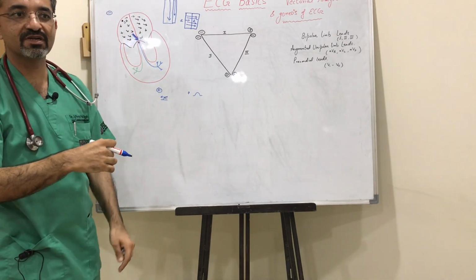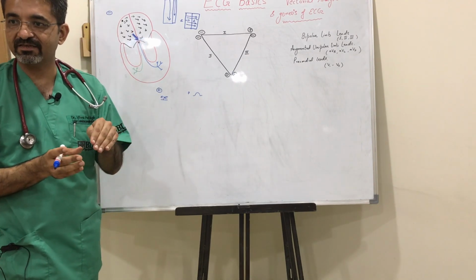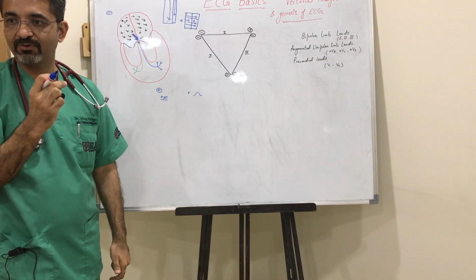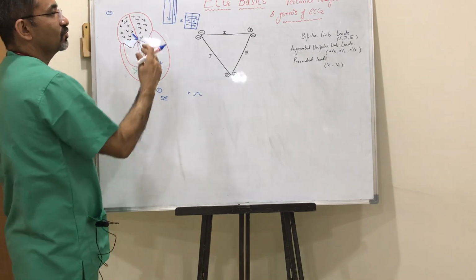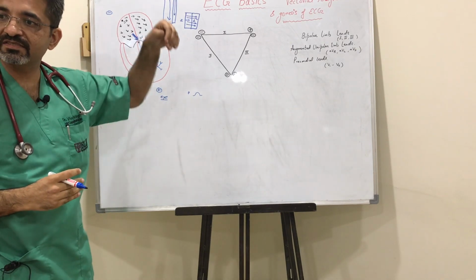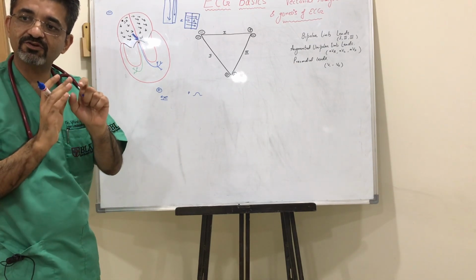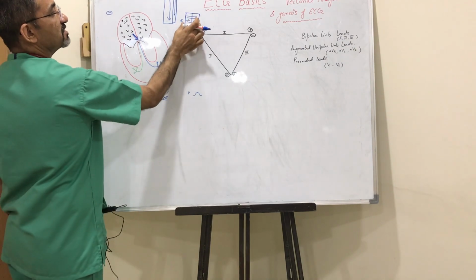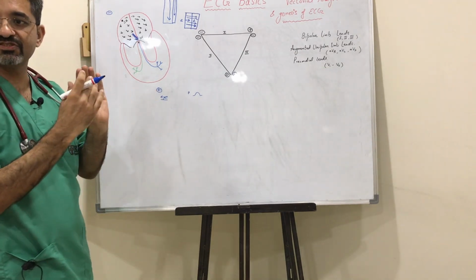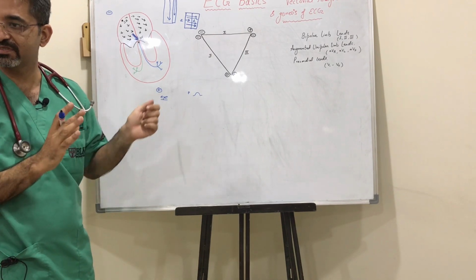When the movement is longitudinal, you cannot judge the thickness, because it has to be a vector, and the power of the vector will tell you the magnitude of deflection. So the direction remains longitudinal. Even though the atrial wall becomes thicker, the direction remains the same, and the intensity of the vector remains the same. So we always say enlargement. We never say hypertrophy, because we cannot judge hypertrophy. Whereas in this case, because the vector intensity will be more as compared to this vector, we can judge the thickness of the ventricle by looking at the ECG. I hope this is clear.